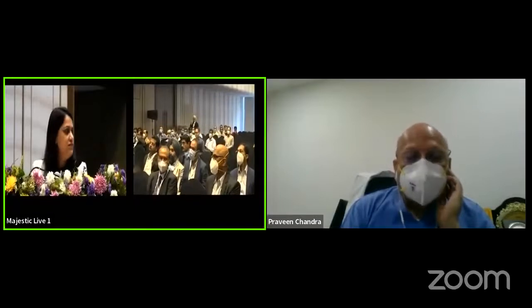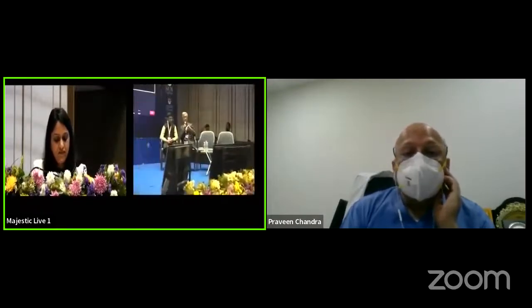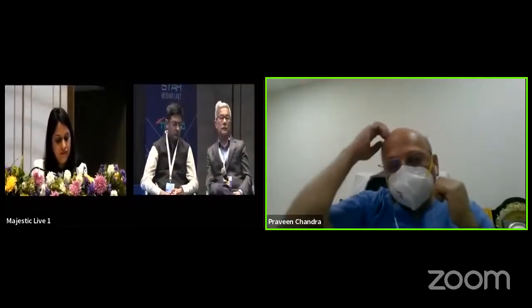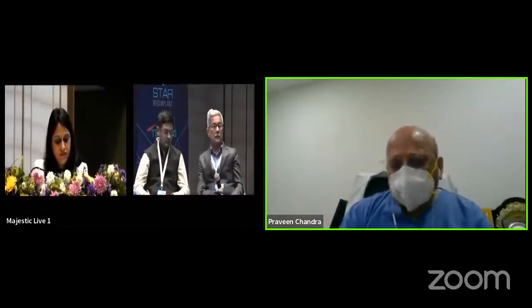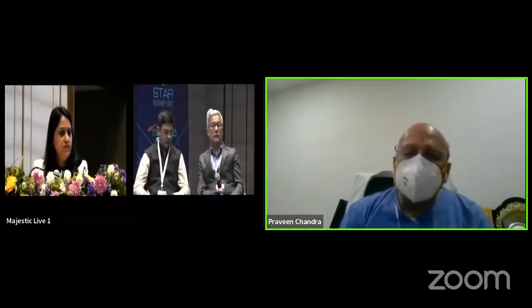Yeah, Praveen, this is Dr. VC Chauhan. Many vascular surgeons like brachial access much better than the subclavian. Is it possible to do the procedure via brachial rather than subclavian, which is easy to cut down, more easily accessible, and has better hemostasis? Yeah. So I think you are talking of axillary, because brachial will be too small. So axillary access is the access which we do most of the times, and that goes through the subclavian artery. They open the axillary artery and then give it through that. So it can be done both percutaneous or open access, no problem.